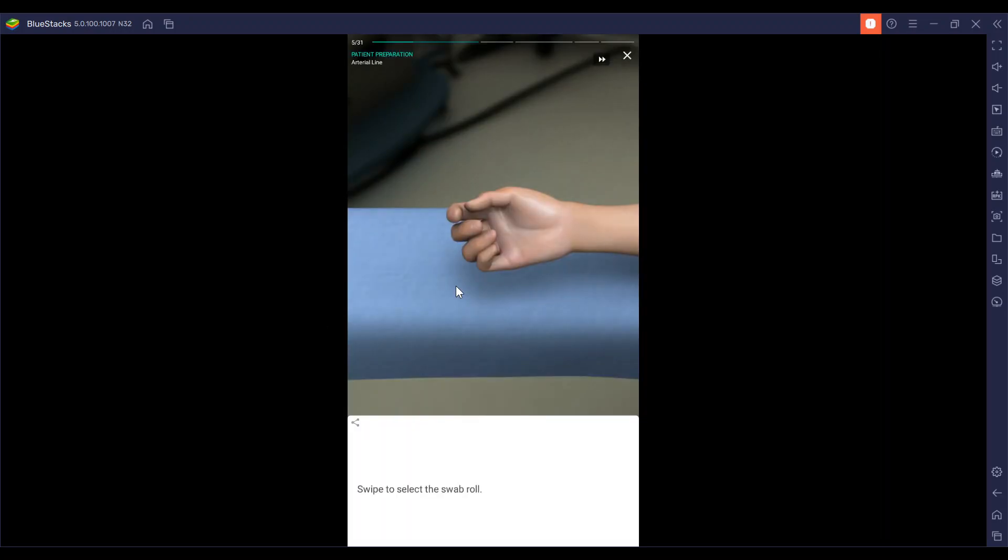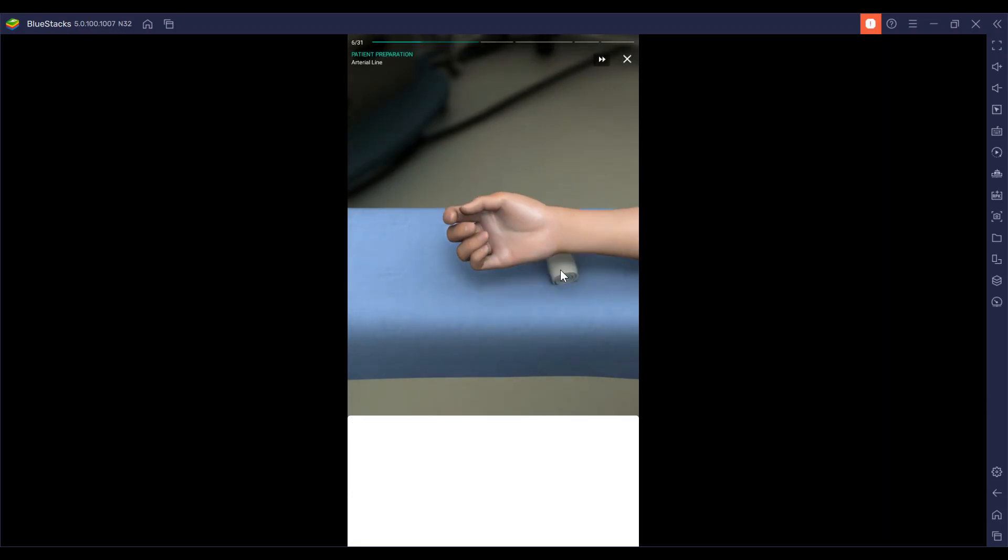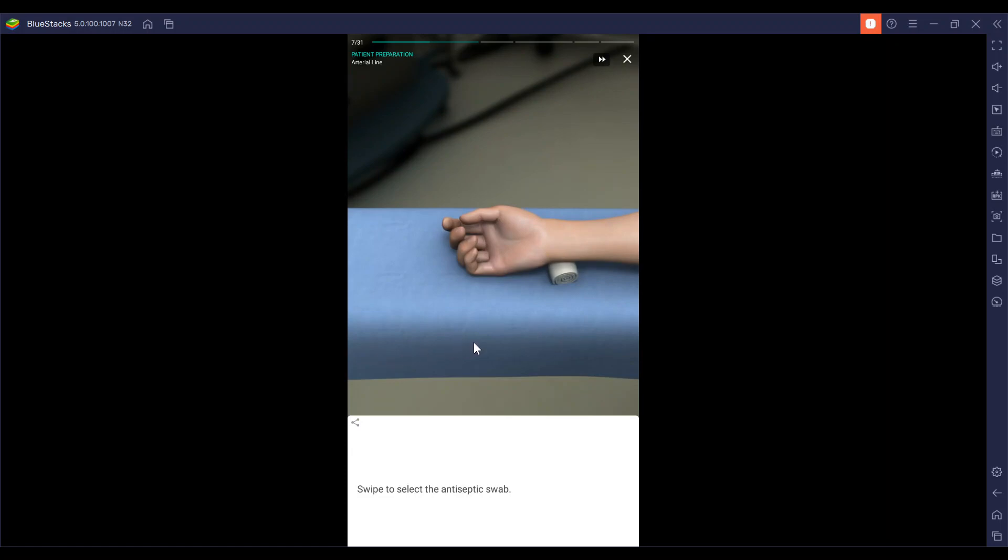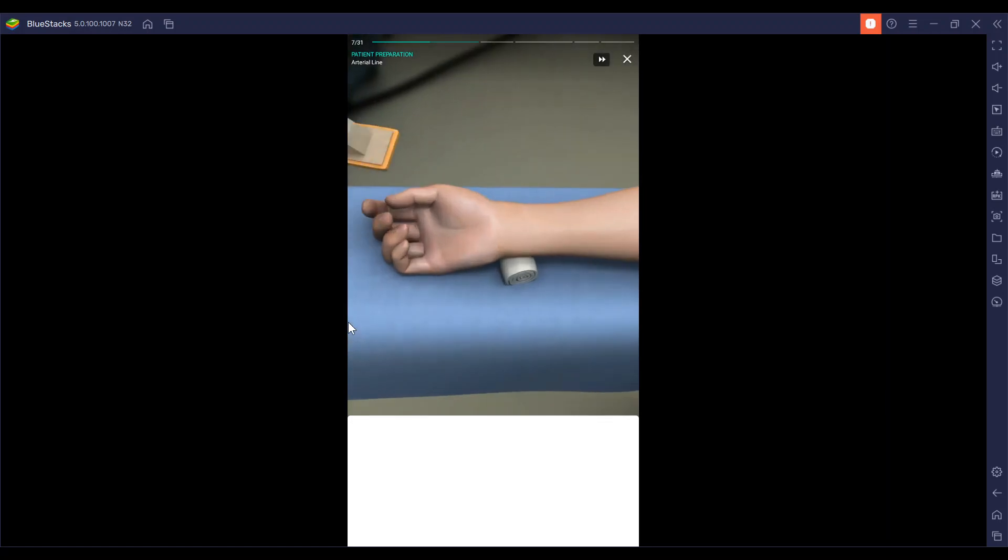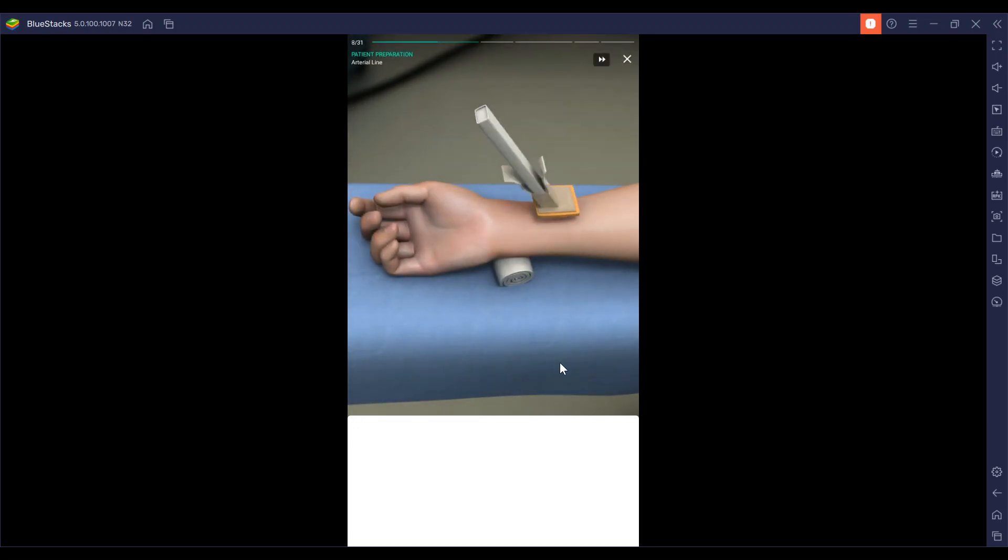Now we are going to grab that gauze, that swab roll. We're going to get that antiseptic swab and use the swab to sterilize the area around the radial pulse and apply it in concentric circles.